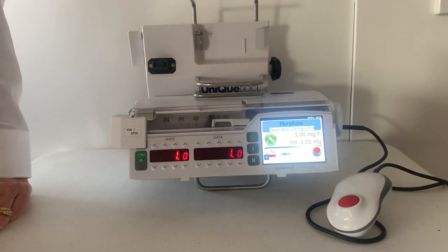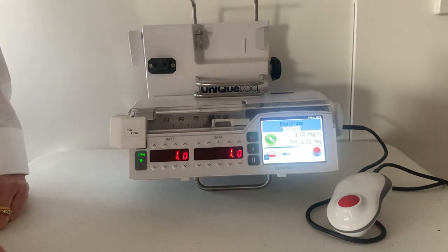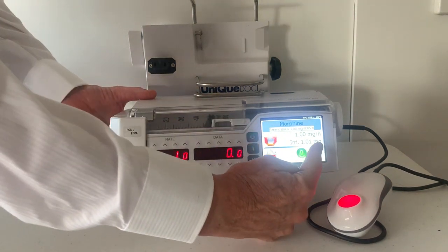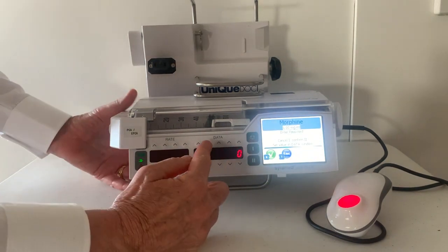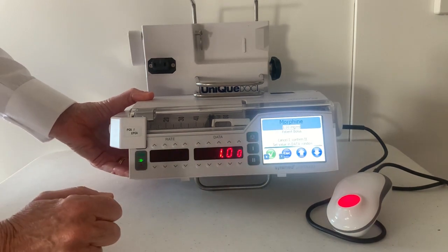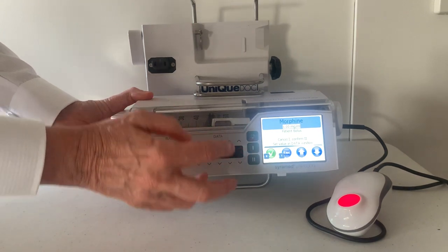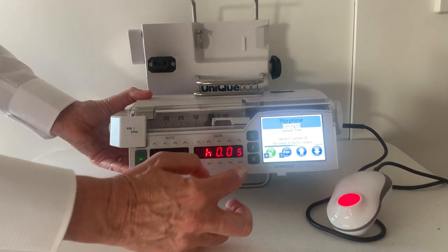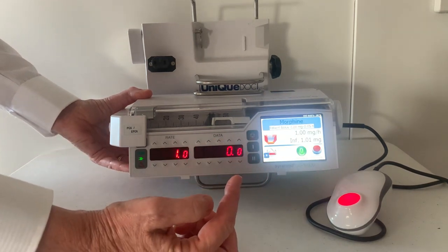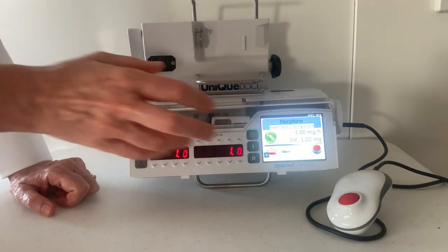If you want to review your PCA parameters, press the PCA icon. If you want to change your PCA parameters, stop the pump, then press the PCA icon — it's asking for the passcode, tick to confirm. I'm going to change the patient bolus to two milligrams and tick to confirm. The other parameters I'll keep the same, so I'll just confirm them. Back to the home screen and restart the pump.